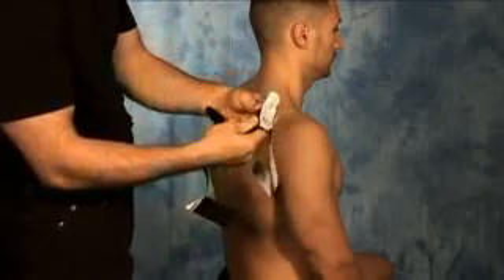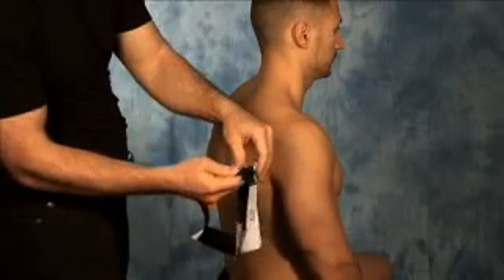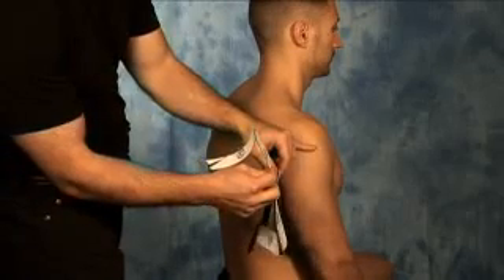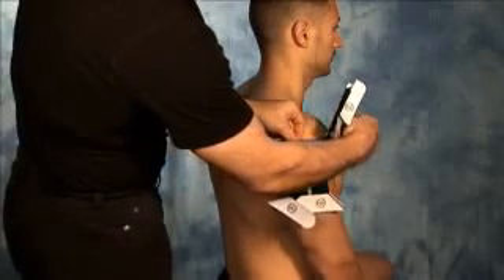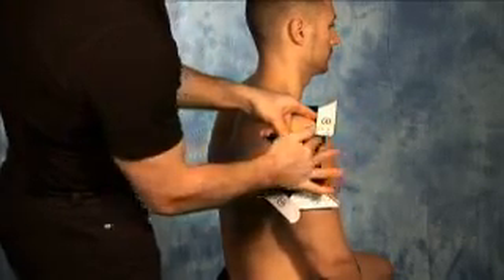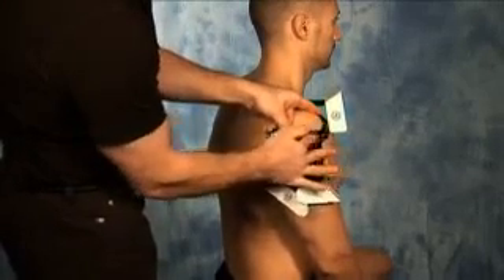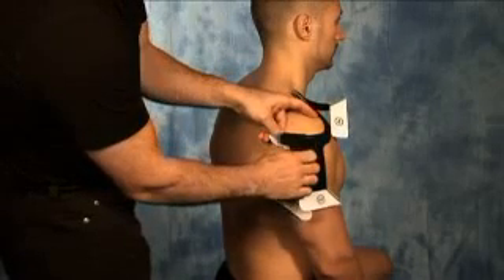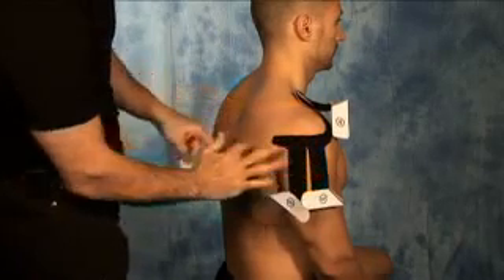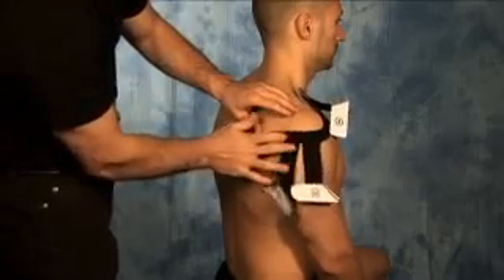For step number one, tear the backing of section number one halfway and apply to the border between the upper part of the arm and the shoulder. Gently rub the tape to activate the glue. Once that portion is applied, tear the remaining portion of section one off, allowing the tape to come in gentle contact with the skin, and then proceed to rub the tape to activate the glue.